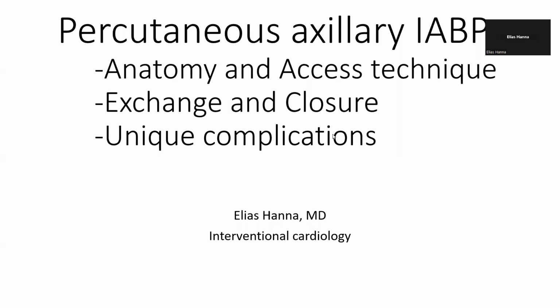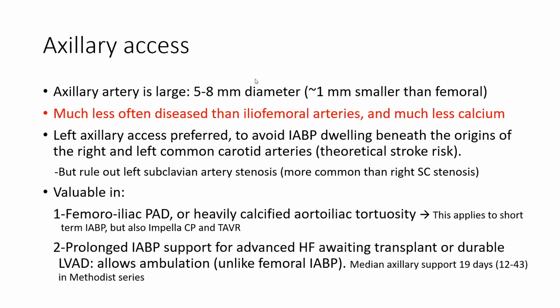So I want to talk about percutaneous axillary balloon pump. I want to talk about the anatomy and access technique, exchange and closure, and the unique complications of axillary balloon pump. So why axillary access?